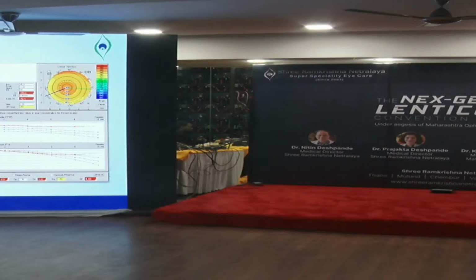Also, we have different parameters like DF, which stands for standard deviation for the front, DB, which is standard deviation for the back, DP, which is the pachymetric progression, DT, which is the thinnest point, centered around the thinnest point, and DA, which stands for the displacement of the thinnest point from the apex. And D is basically the average of all these parameters. So it is a very good indicator which helps us to find out abnormal cases.